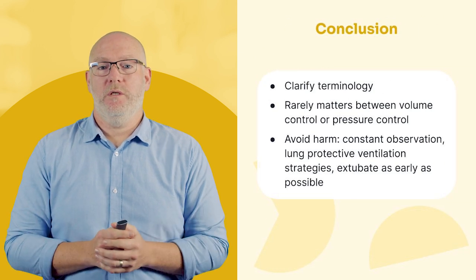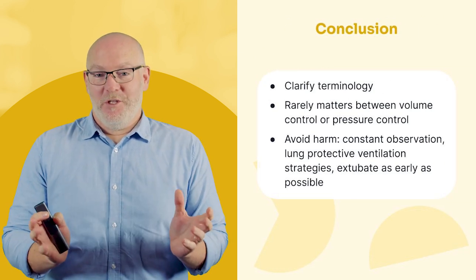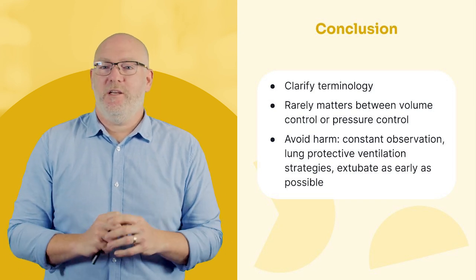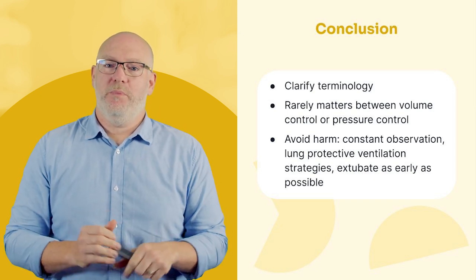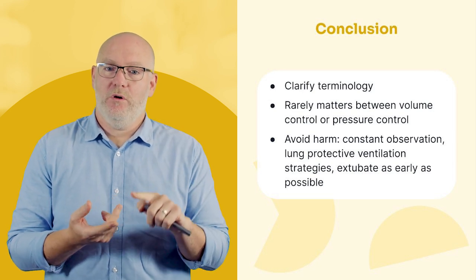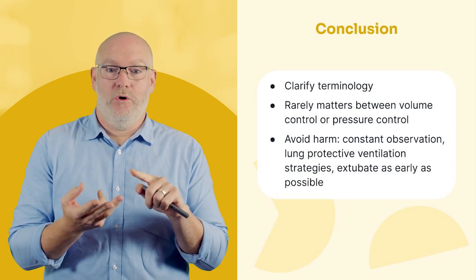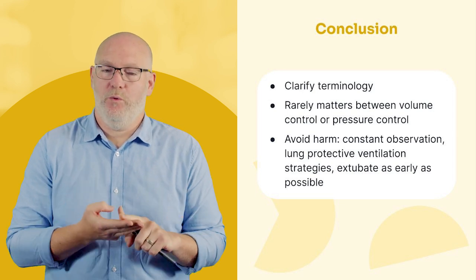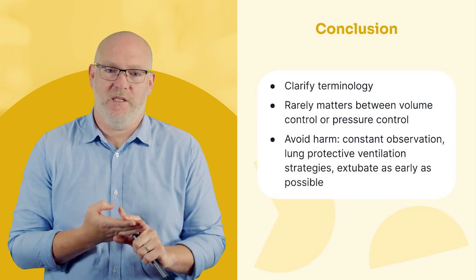So in conclusion, terminology. I think ventilator companies are pretty good at confusing us with fancy terminology, but I think ultimately if you can pin them down to thinking, is this a volume control, a pressure control, or a pressure support type mode of ventilation, you'll be able to work your way through that 9 times out of 10, okay?